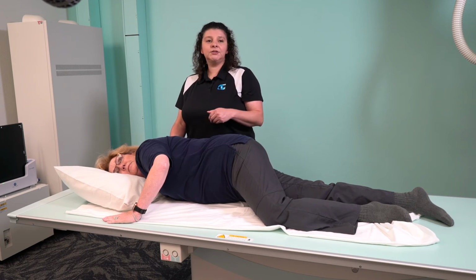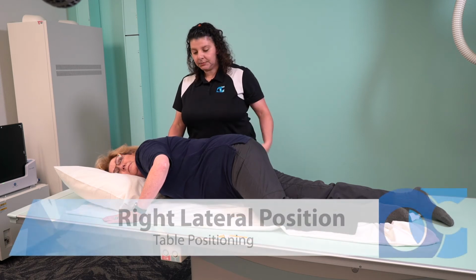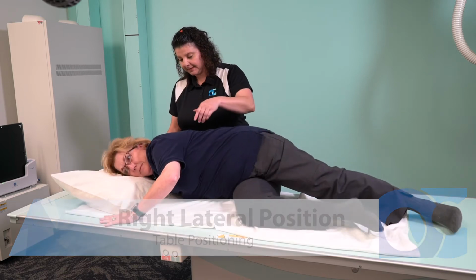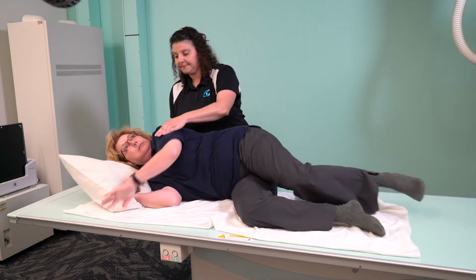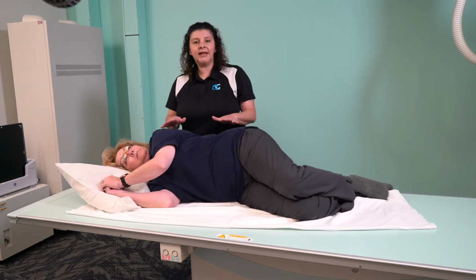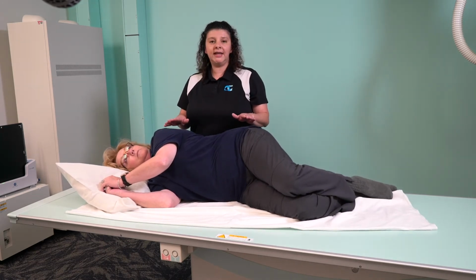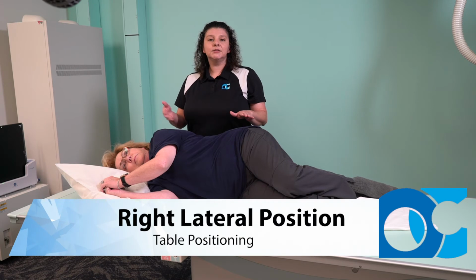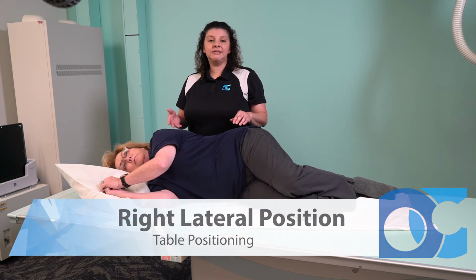Now I'm going to get her into a lateral position. We're going to lay her onto her side. If you'll lay facing that way, her arms are going to go forward. Good. When we have patients on their lateral side, the laterals are named according to the way the patient is laying. She is laying on her right side, so this is a right lateral position.